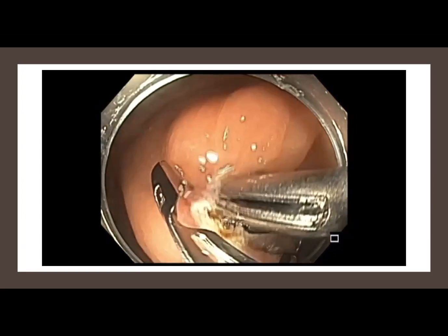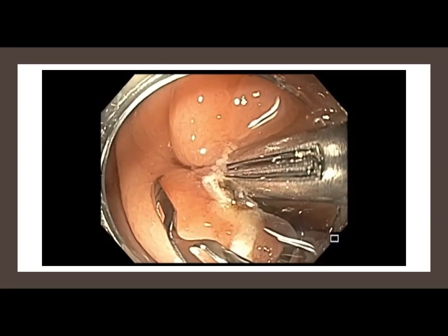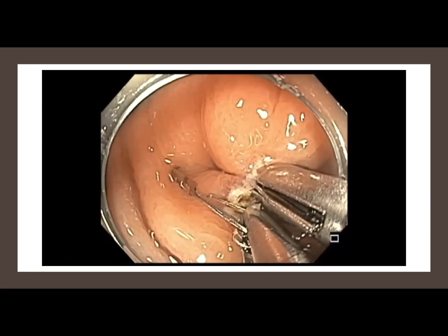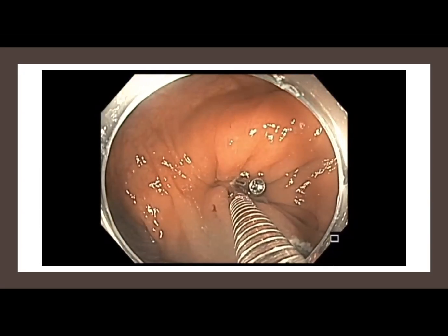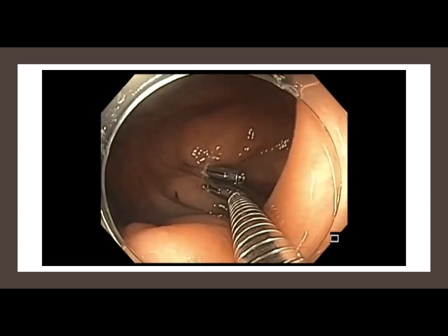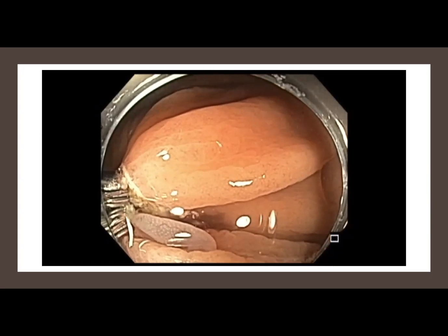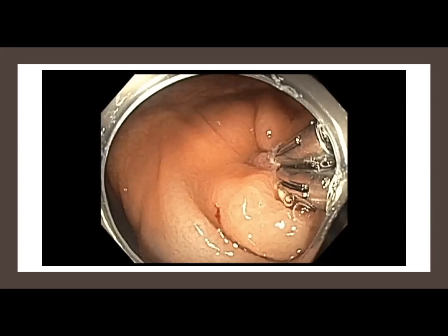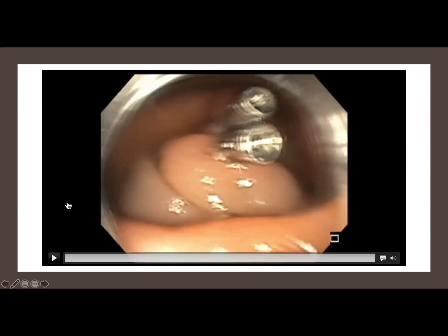And we decided to apply one more clip to just make sure that we have a complete closure. And it's also important to keep in mind, whenever you're doing cases that are referred to you, where are they coming from and how far are they? This patient came from almost 5-6 hours away from Houston. All right.